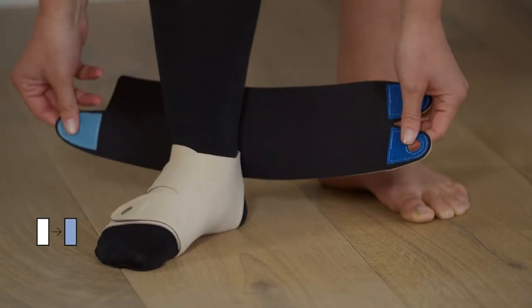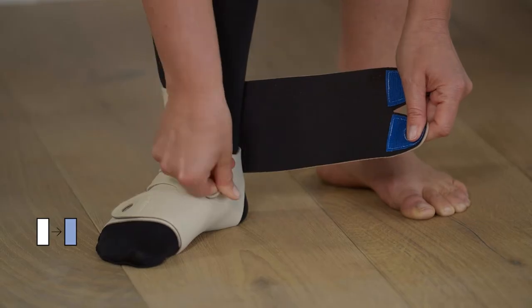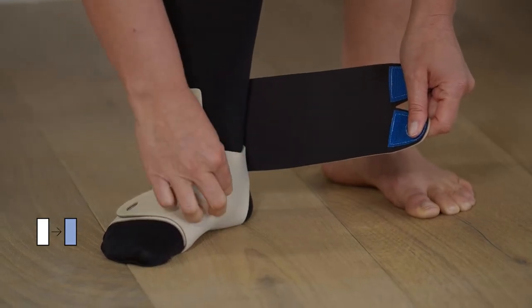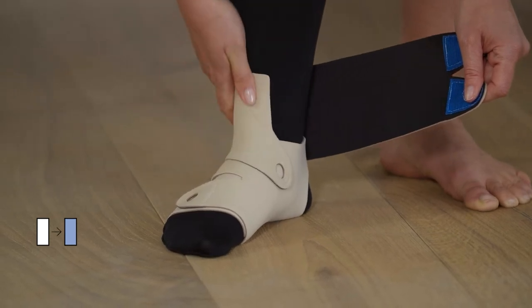Pull the ankle strap across the front of your foot at a downward angle and fasten it to the opposite side. Make sure that the fastener is placed fully on the product and not touching the liner.